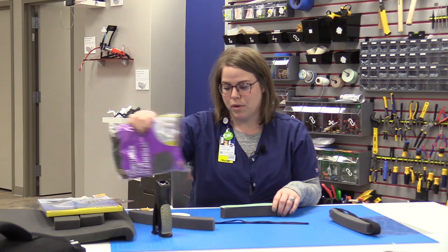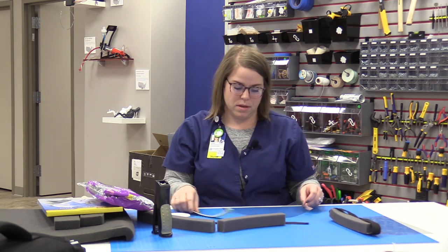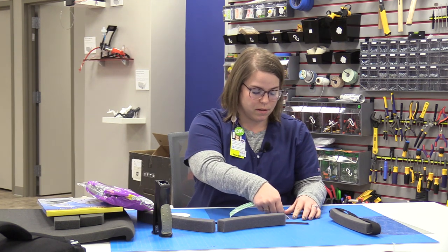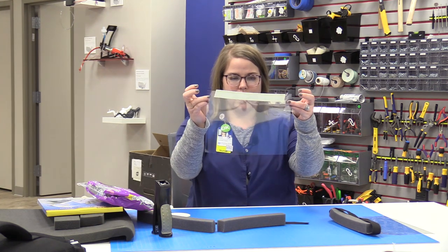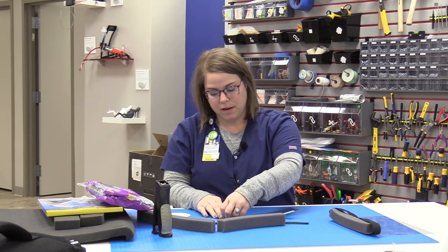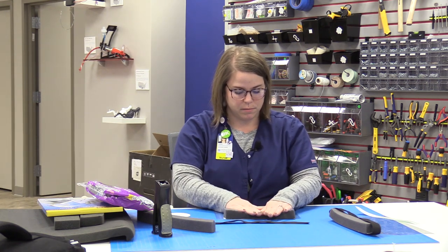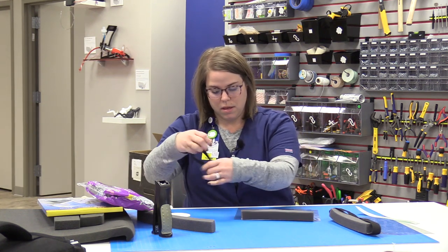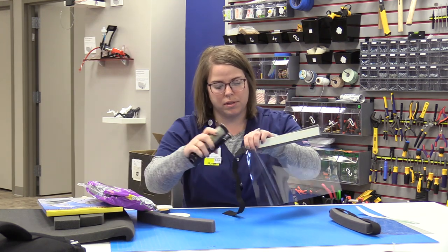I have my materials pre-cut here. We'll take our transparency film and our double-sided adhesive tape and put that on our transparency film, leaving about an inch on either side. Then I'll take the other side of the tape off, place my foam over top of that, push it down, and give it a good seal. Then I'll take my elastic and use that one-inch margin to staple a couple of staples on each side.